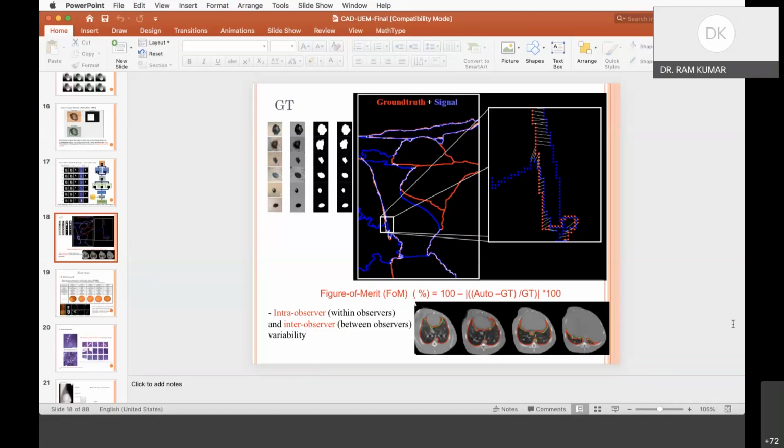Okay. So the next part is, once you have the ground truth, so you are properly able to segment a particular region of interest, now you have to extract the features. For traditional machine learning, one prominent feature is the color-based feature. But unfortunately, most medical images, if you study radiological images, are not colored. Only the ophthalmo images or the derma images, or sometimes the teeth images, are basically color images. So color images, like if there is a disease called diabetes.